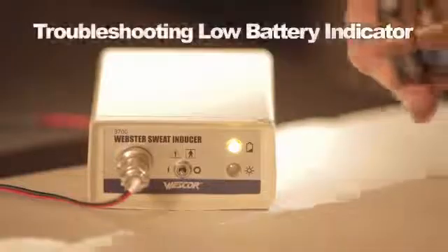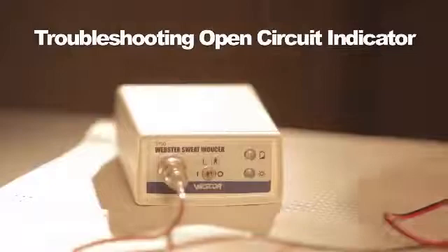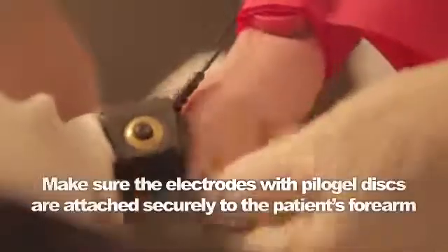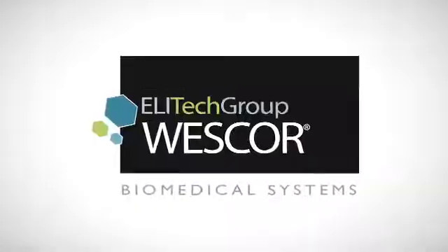When the batteries are low, the low battery light comes on and an alarm sounds when the switch is pushed to run. There is a built-in open circuit alarm that sounds when current is not able to flow between the electrodes. Make sure the electrodes are clean and unmarked — if necessary, clean or replace them. Make sure electrodes are strapped securely to the patient's forearm. Refer to the manual for more troubleshooting procedures. Thank you for your attention and participation in this Macroduct sweat collection training.